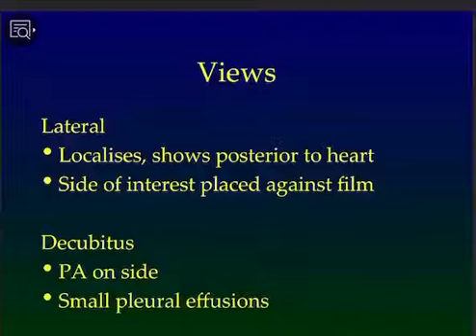Okay. So he's lying supine, then he's turning to one side, and now X-rays are passing from the back to the front. So in that way, the X-rays will be horizontally oriented. This is called horizontal beam film. The X-ray beam will be horizontal, okay, not vertical. In AP view, while the patient is lying supine on bed, the X-rays are vertical, from above to behind. But in decubitus, the X-rays are horizontal.